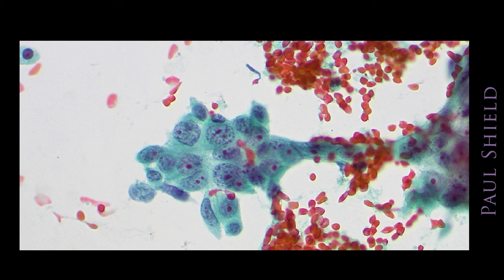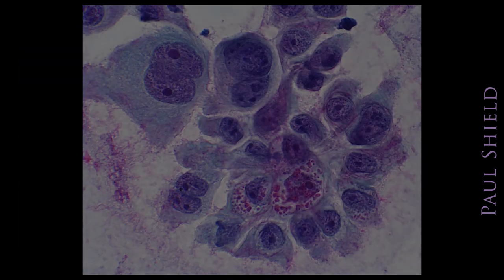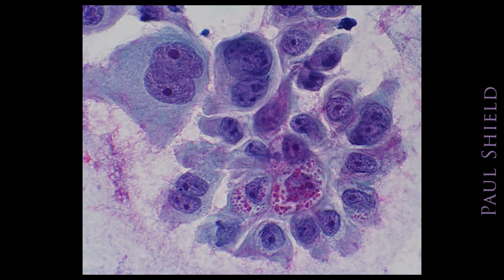As you can see here, the nuclei are still pretty round. They're varying in size, but most of them are fairly round or oval in shape. Chromatin's looking a little irregularly distributed in especially the top two nuclei there, but it is still fairly fine compared to SCC. Here's a higher grade tumour, and you can see massive variation in size and shape in these, very prominent single central nucleoli, but in this case still fairly fine chromatin in the nuclei.